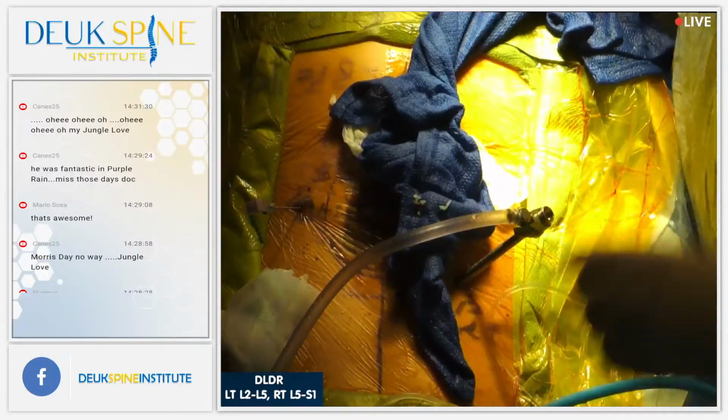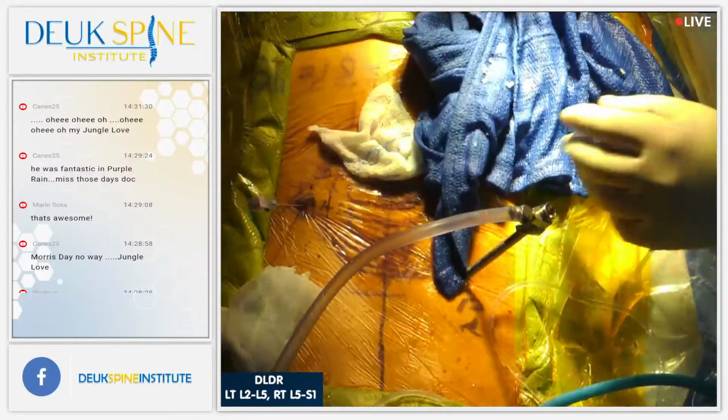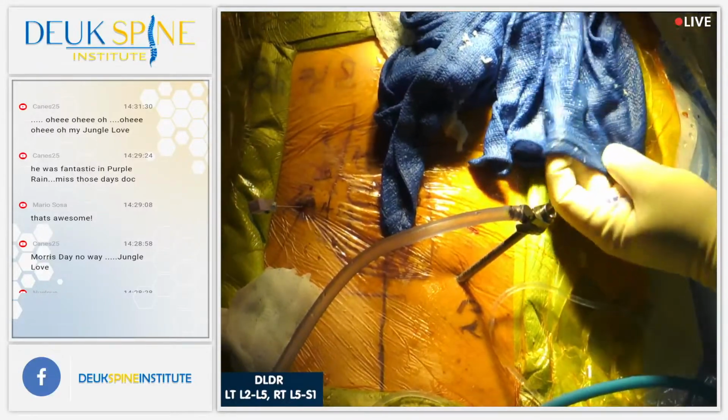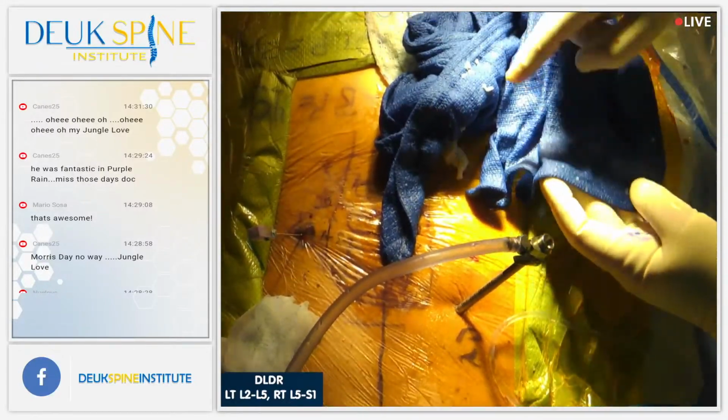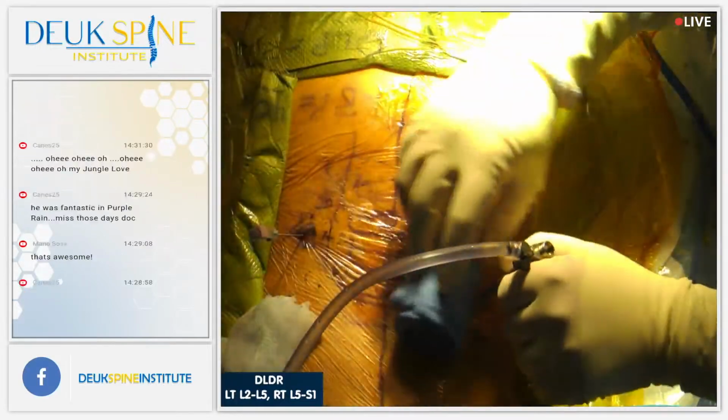Oh, by the way, can you see this here, Henry? Remember we were talking about how the laser breaks up the disc into lots of pieces? You see all these tiny little pieces of herniation everywhere, right? Yes, we do. That's from the laser breaking it up.